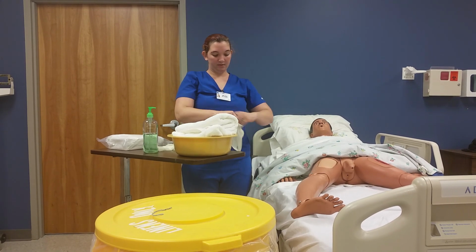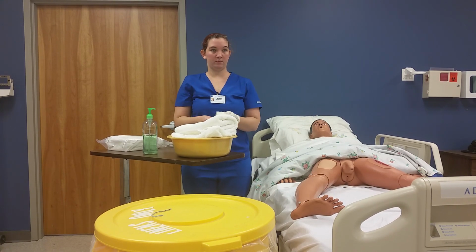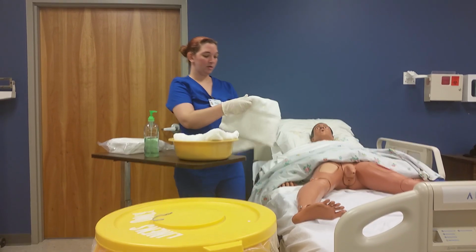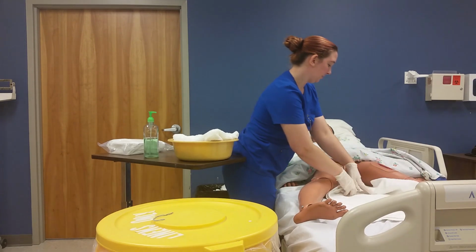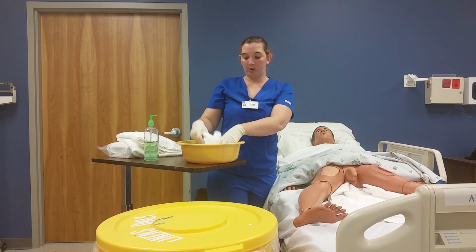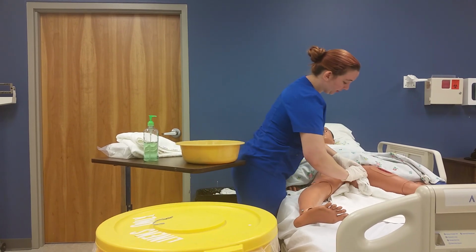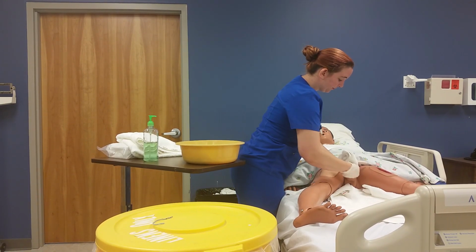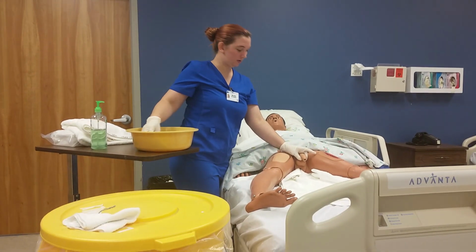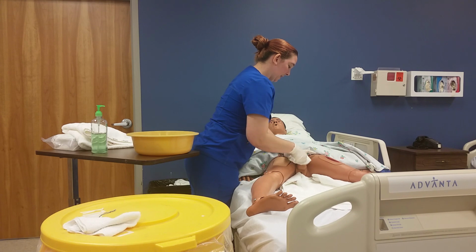I'm going to place my gloves on. I'm going to place a towel here just to help keep from getting this bed wet. I have another towel here. I've already got some lukewarm water going here. We're going to take the first wash rag and we're just going to clean in a circular motion. I have my linen barrel here, so I'm going to get rid of that one. I'm going to take this one, clean in a circular motion. We're just working our way down.